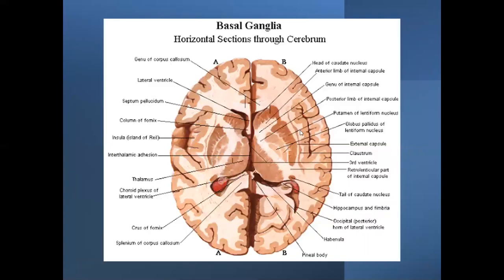In the cross-sectional anatomy you can see the lateral ventricle and the third ventricle. This is the head of the caudate nucleus, and this is the internal capsule with its anterior limb, genu, and posterior limb. This is the caudate nucleus and this is the thalamus. Here you can also appreciate the tail of the caudate nucleus.